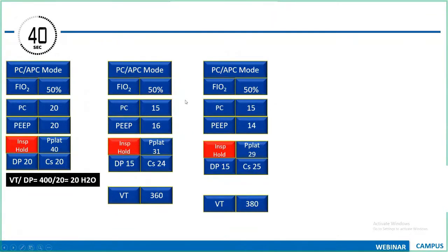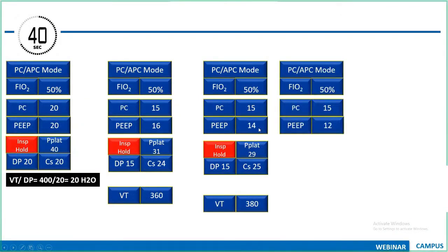Again, there is nothing like a fixed time. You can give it somewhere around 5 to 10 minutes and wait to see what changes happen. So now I don't know whether the 14 is adequate, so I am changing to 12. When I change the PEEP from 14 to 12, again you can see my plateau pressure is dipping, the compliance is improving, and obviously the tidal volume also has to improve.